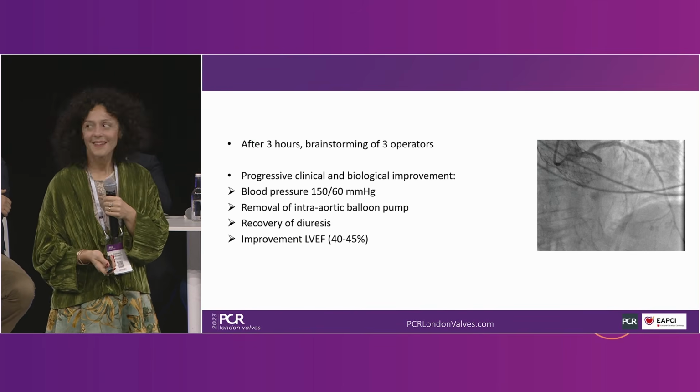Thank you. So yeah, I think Francesca, Verena, you really put the stage here. It's a real problem that can occur in clinics: post-TAVI, having difficulty with coronary access. You already highlighted a couple of solutions with support catheters, extension catheters, microcatheters, whatever solutions, but we will come to talk about that later.